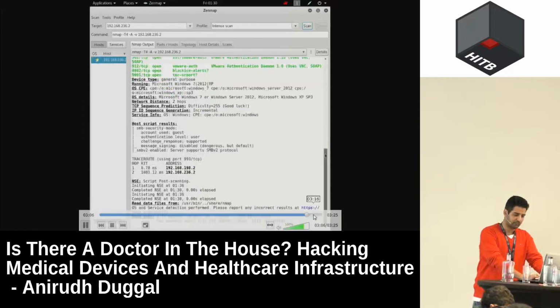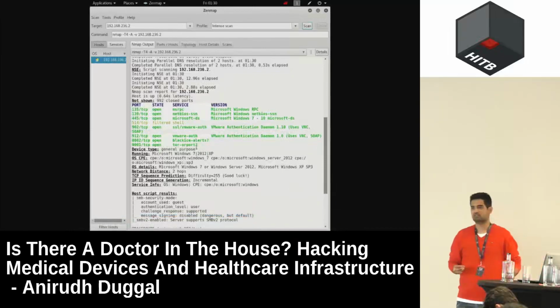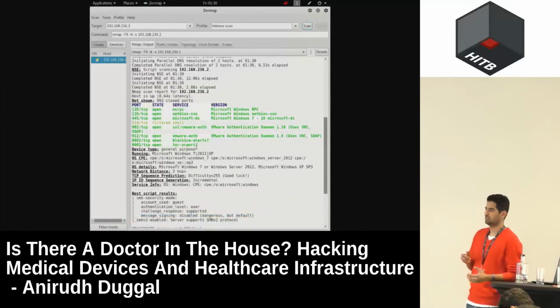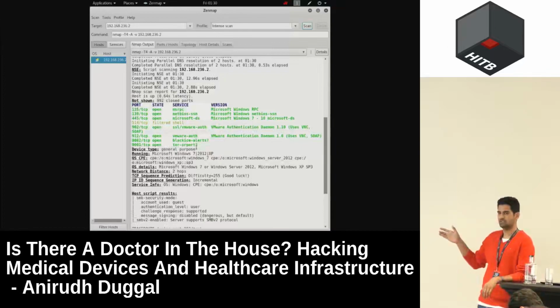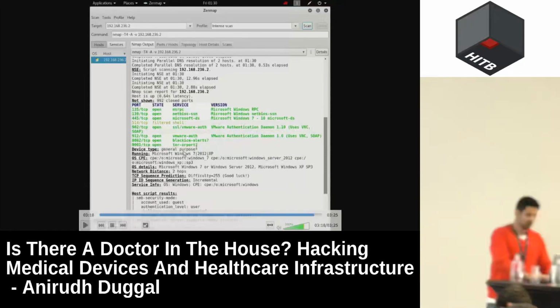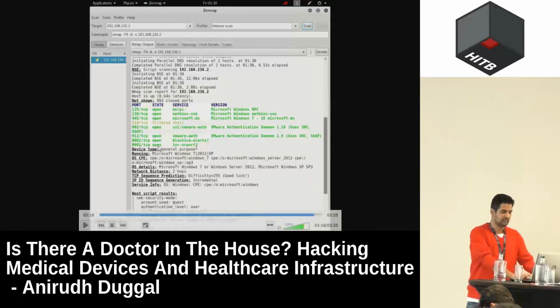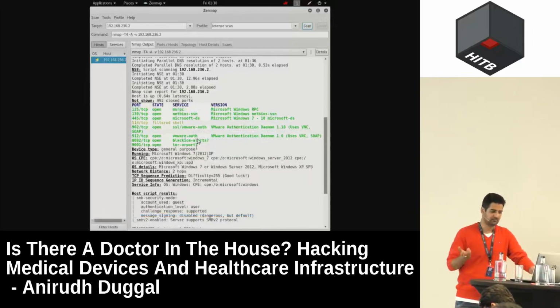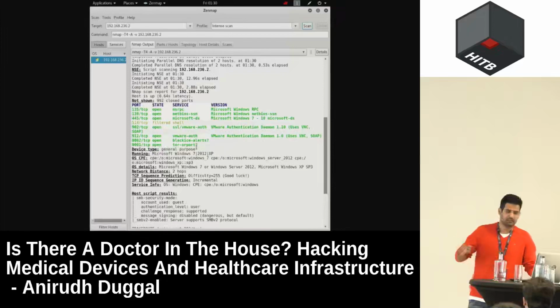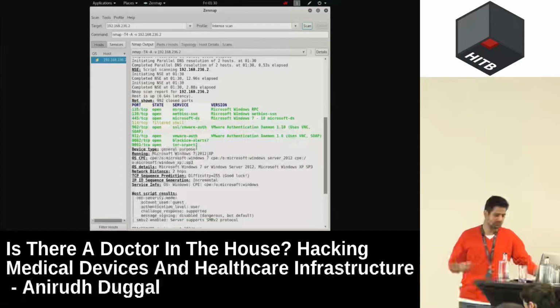This is really common, and the reason is that Nmap doesn't understand that I'm running a service here. For it, it's the conventional ports that matter. So it detected Tor, and 8082 as blackice, whatever that protocol is. And if you scan more ports, it'll detect some other garbage information.